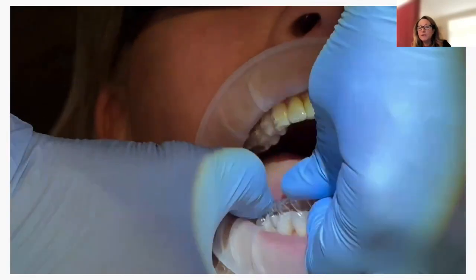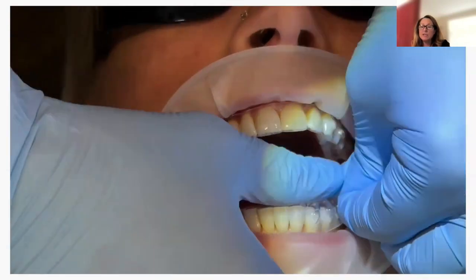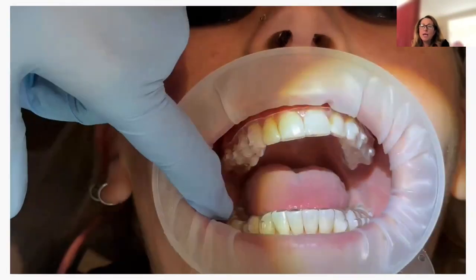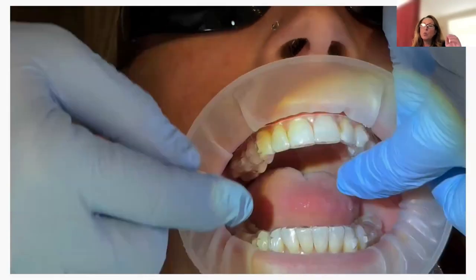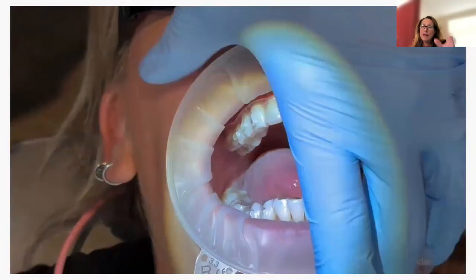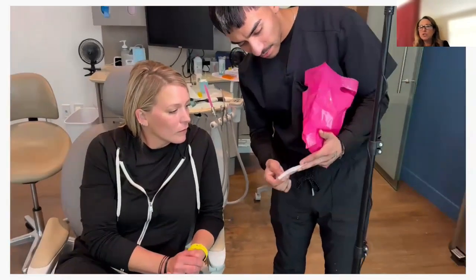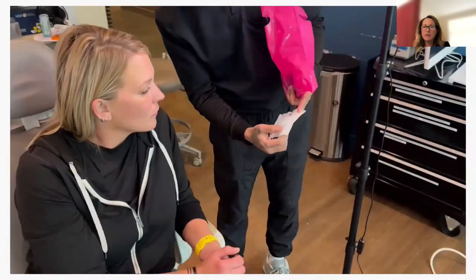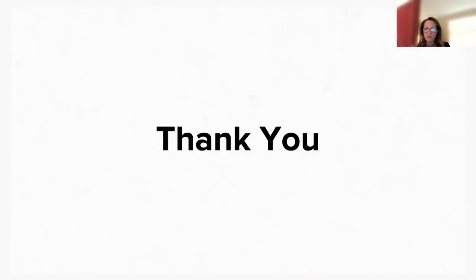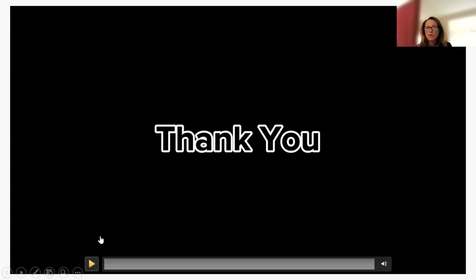So sometimes, like, patient has that area that was missing a tooth, that side is easier to go down. So I like to show my patient which path of insertion is easier to get it on and to take it off. And then, your instructions, I like to give a goodie bag. And he's explaining that, okay, we're going to do this for a week.